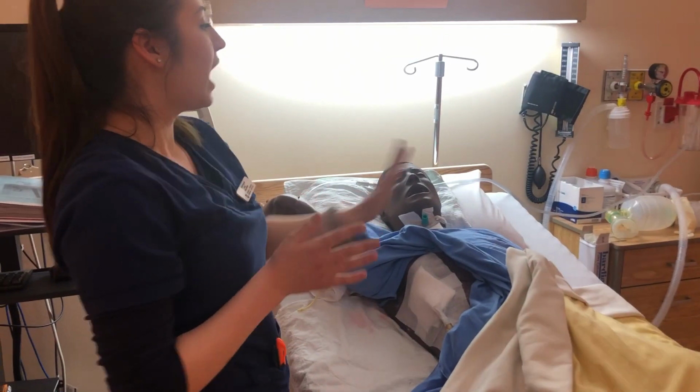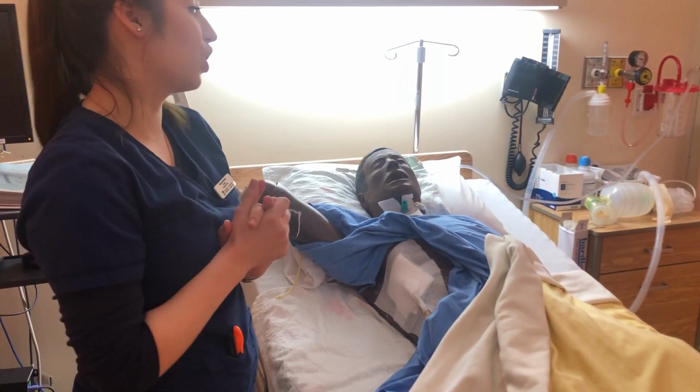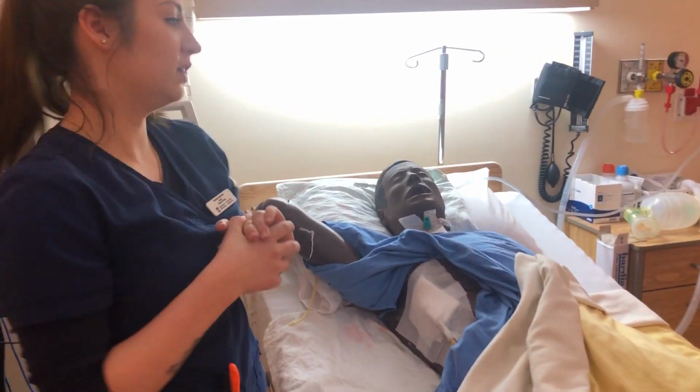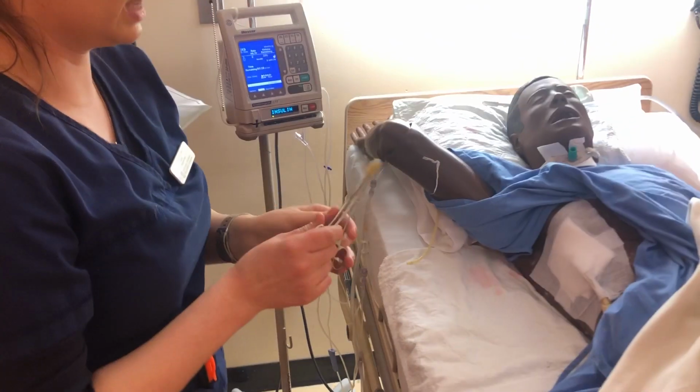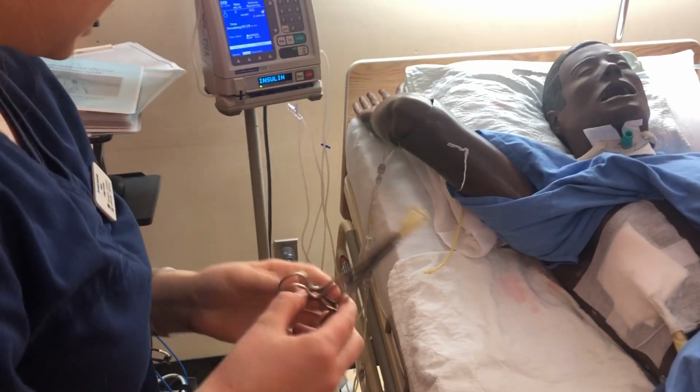Alright, the last thing for my chest tube safety check, I want to make sure that I have normal saline or sterile water at the bedside, just in case the chest tube becomes disconnected, as well as these clamping forceps to check for air leaks.